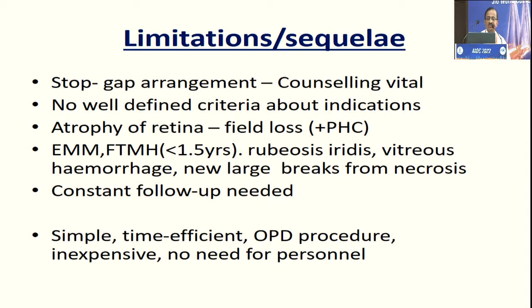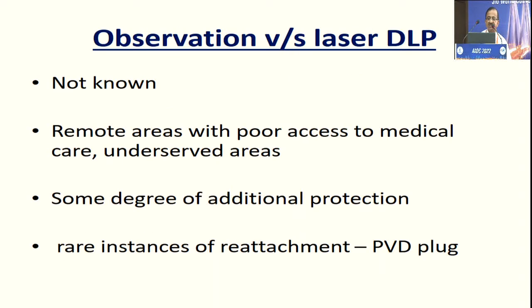There are issues related to treatment per se in the form of field loss and epiretinal membrane formation, full thickness macular hole formation, etc. Constant follow-up is needed, but even so, it's a simple, time-efficient OPD procedure, inexpensive, and it doesn't need any really trained personnel. Even those with basic knowledge in medical retina can do the lasers in specific situations.